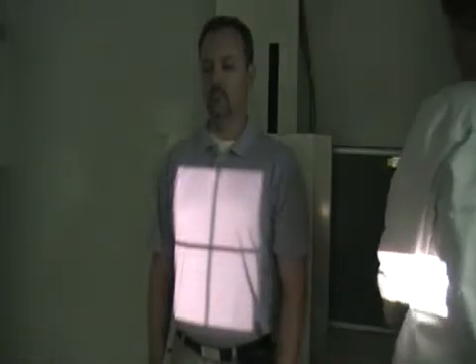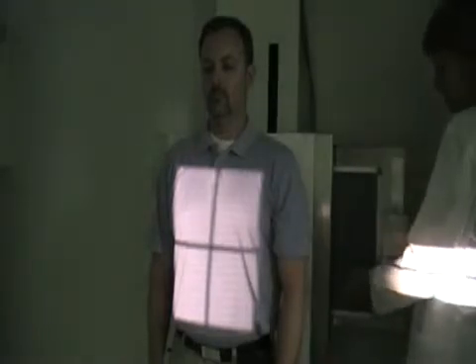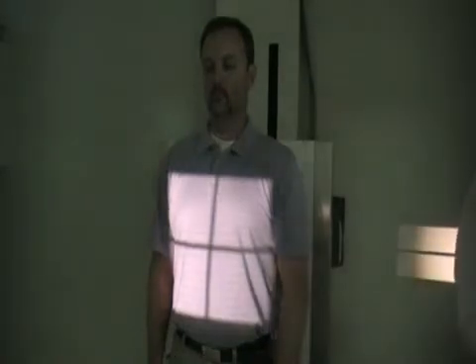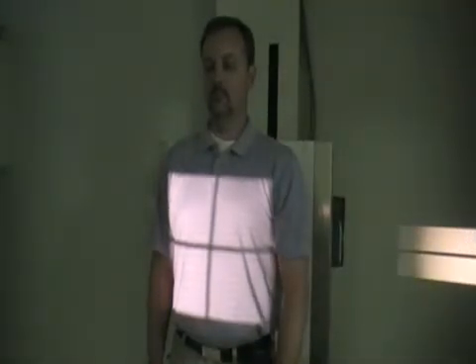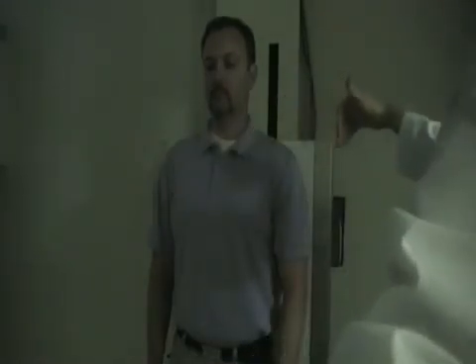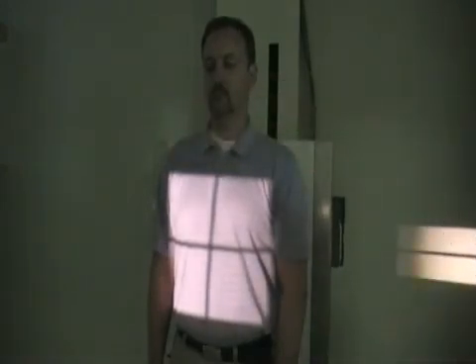And I'm going to go ahead and put the image receptor crosswise so that I know that I won't be cutting off either side, especially if this is a patient that has width to them. So with the lower ribs, you'll have them take in a breath, blow that breath all the way out, and then you would hold it out. And again, you would place your markers accordingly to the side of the body. So when it's AP, we're looking at, this is the left, that's the right, so place your markers accordingly.